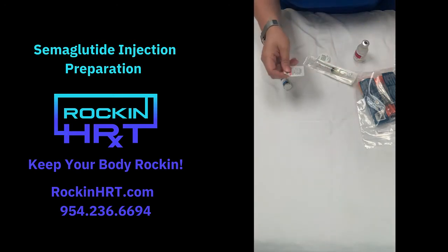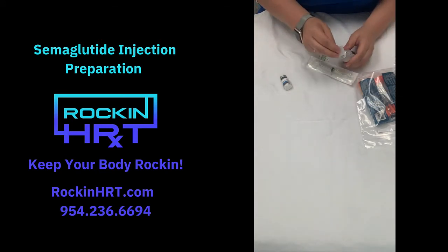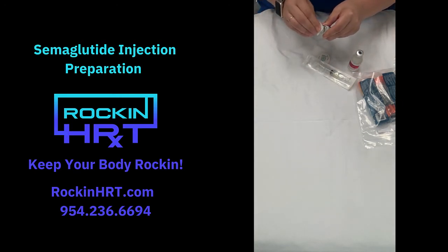So we can take one of these, open it up, and you just want to wipe off the top anytime you go to withdraw out of the top of these. Make sure everything's nice and clean.